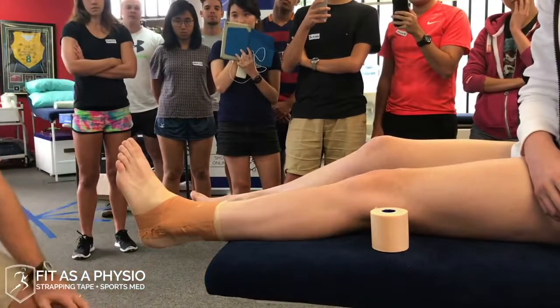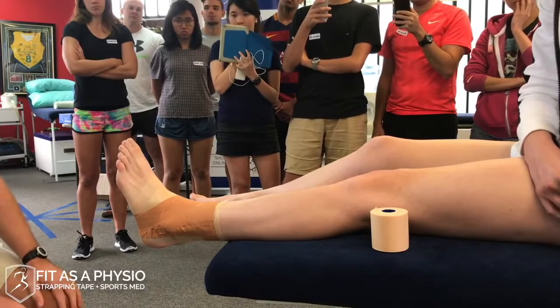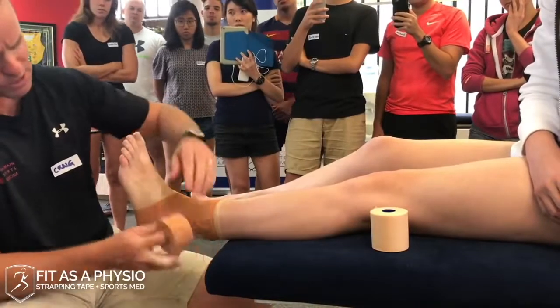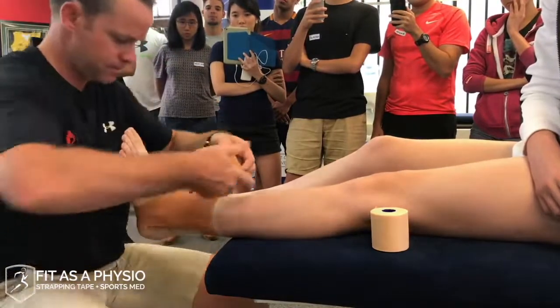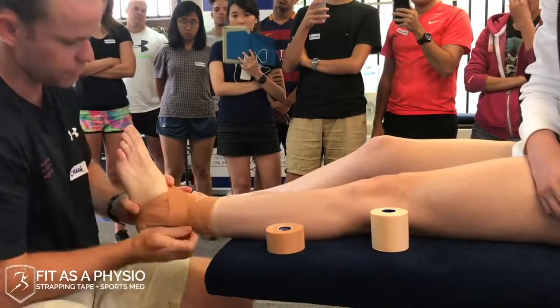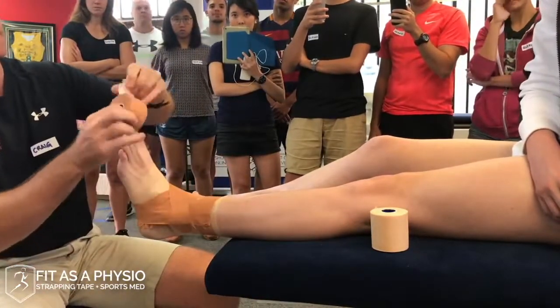You can also do a reverse six. As a standard I tend not to, but if someone has had a little bit of medial sprain as well, you start laterally and come up medially, giving the deltoid ligament a little bit of support on the medial side. Again you can do it once or twice — depends who's paying for the tape.